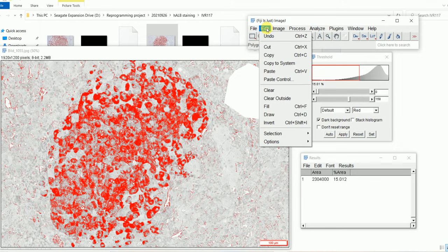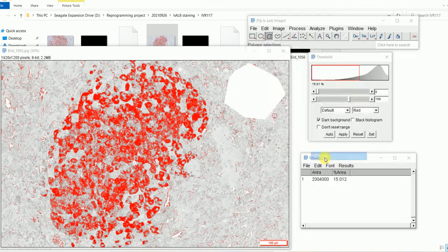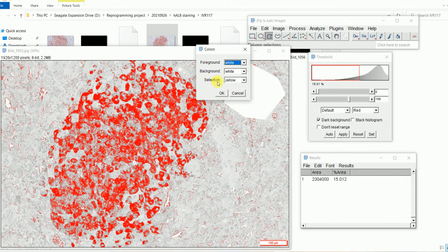So what you will have to do is go to edit and then to options, and in the options you need to go to color. For selection you will keep yellow, but for foreground and background, for both of these you are going to make it white and white. Okay, then only this thing will appear white.